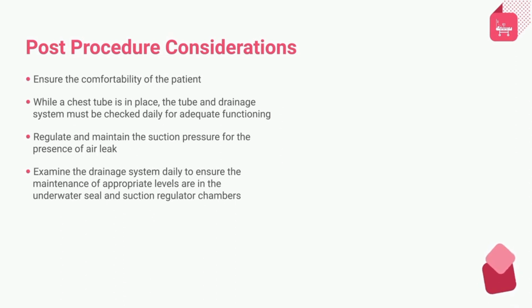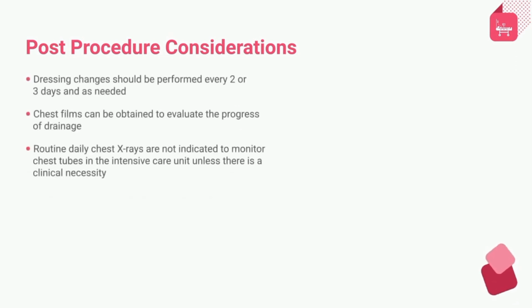Routine daily chest X-rays are not indicated to monitor chest tubes in the intensive care unit unless there is a clinical necessity. If a pneumothorax persists, increasing the suction level may be beneficial, but an additional tube may be required.